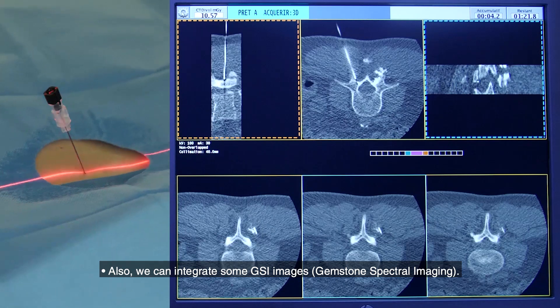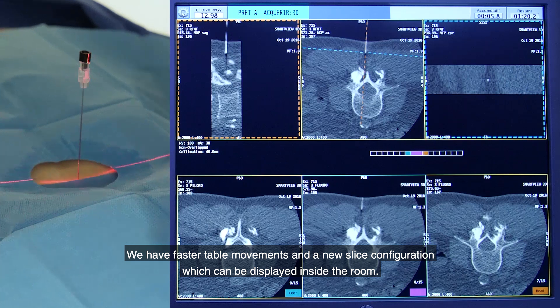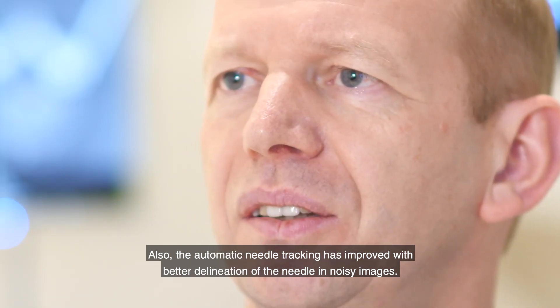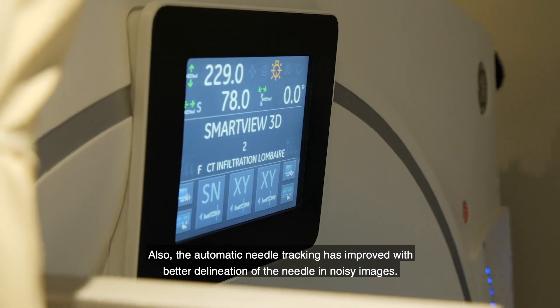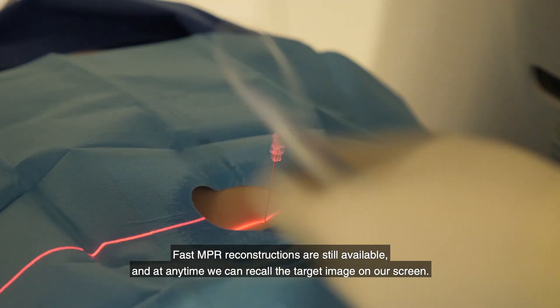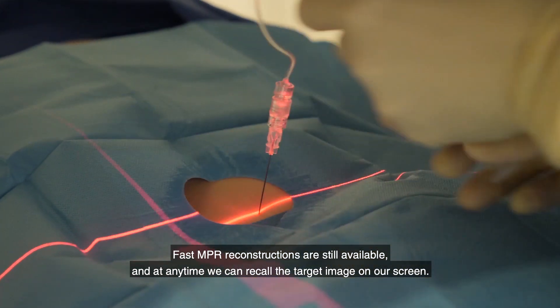We can integrate GSI images, and there are faster table movements and a new slice configuration which can be displayed inside the room. The automatic needle tracking has also improved, with better delineation of the needle in noisy images. Fast MPR reconstructions are still available, and at any time we can recall the target image on our screen.